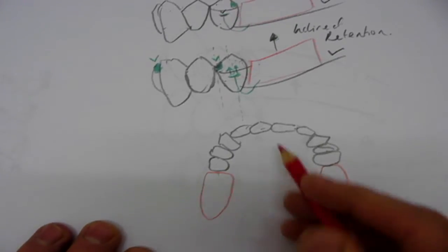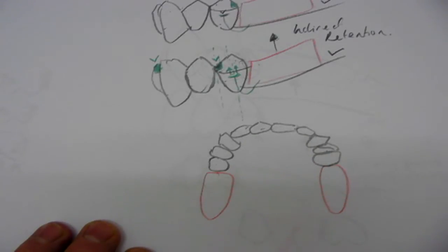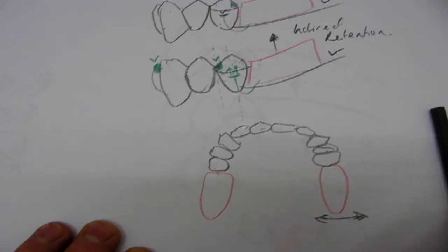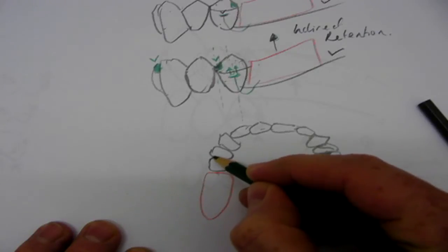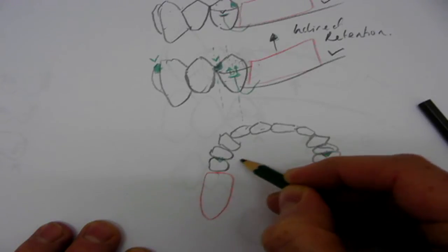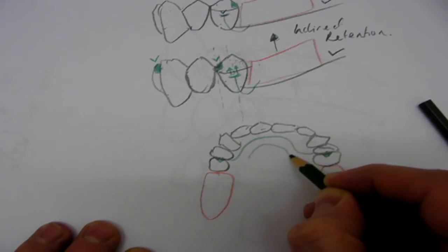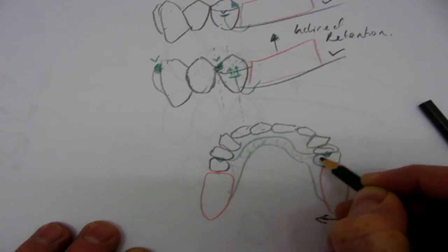And then you can imagine if this was a lower, it's difficult, and the alveolar ridge is resorbed. That's the most challenging situation to provide bracing, i.e. to stop the saddle areas moving sideways like this at the back. And it is suggested that if we put mesial rests in like so when we have a free end saddle, and these are of course connected up with one of our nice rigid connectors like this, something like this. This is all our rigid connector around here.